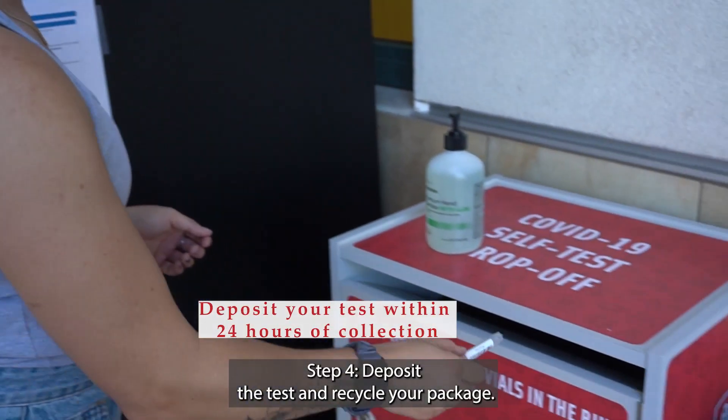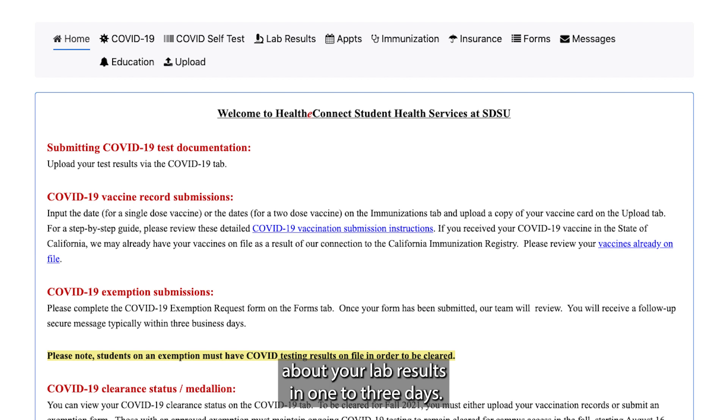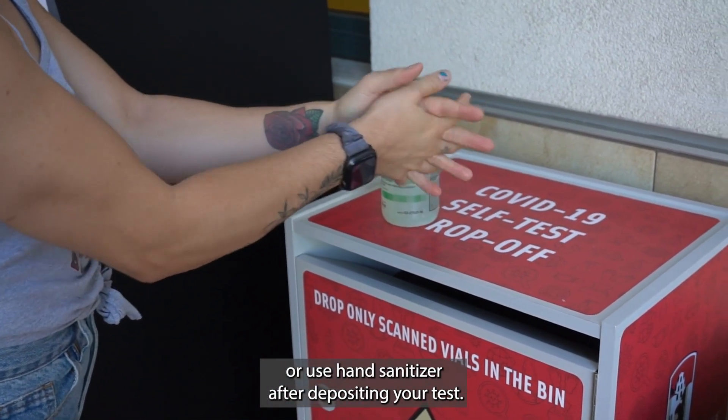Step 4: Deposit the test and recycle your package. Step 5: Check your results — monitor your Healthy Connect for a message about your lab results in one to three days. Step 6: Wash your hands or use hand sanitizer after depositing your test.